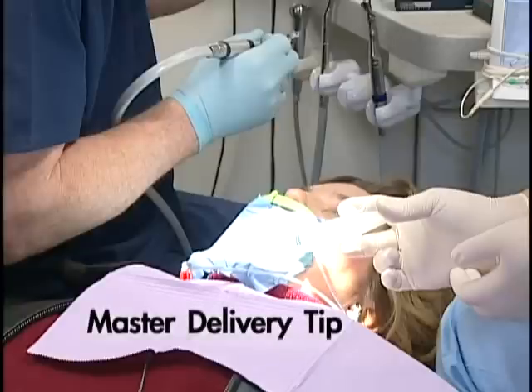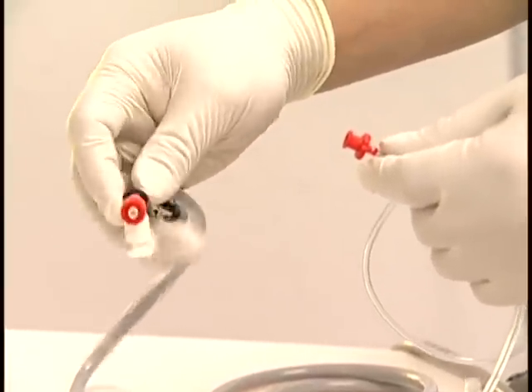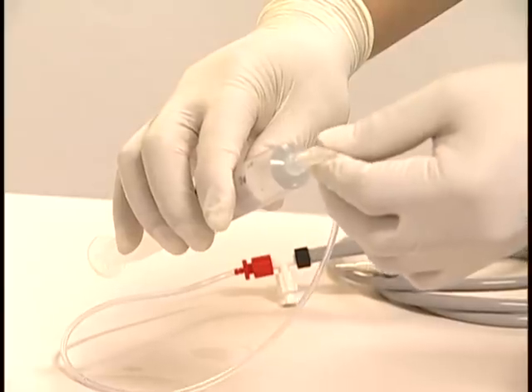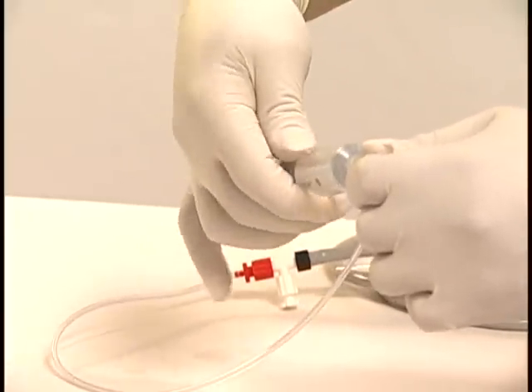I'm going to assist the doctor by irrigating the pulpal chamber during the access procedure. We use the Endovac master delivery tip. I first attach the master delivery tube to the T-connector on my high-vac adapter. Then I attach the master delivery tip to my irrigation syringe.